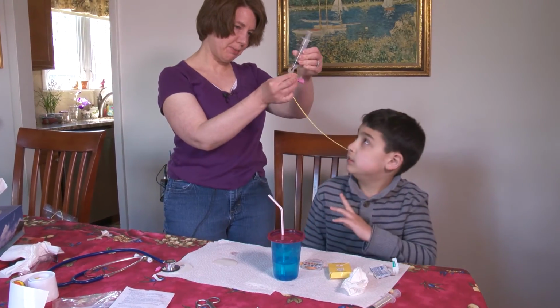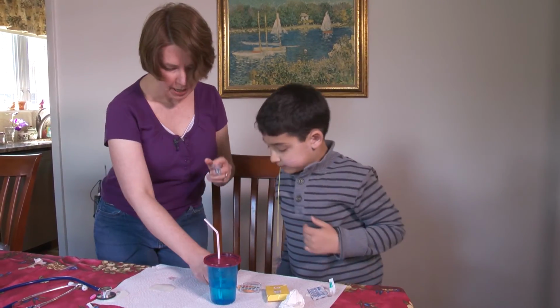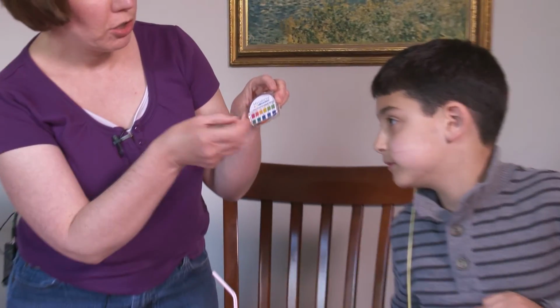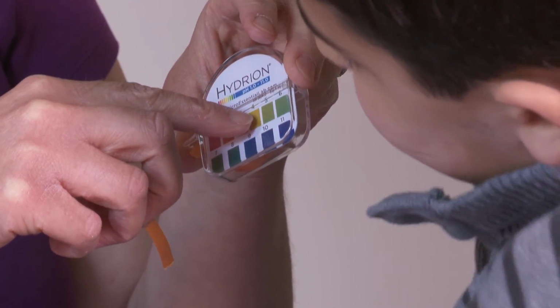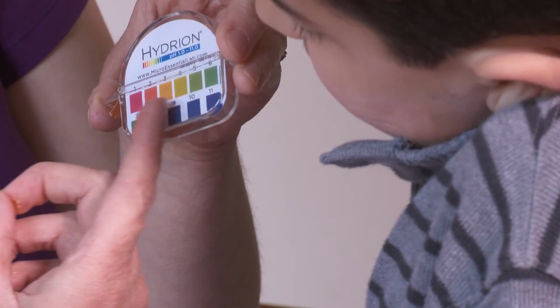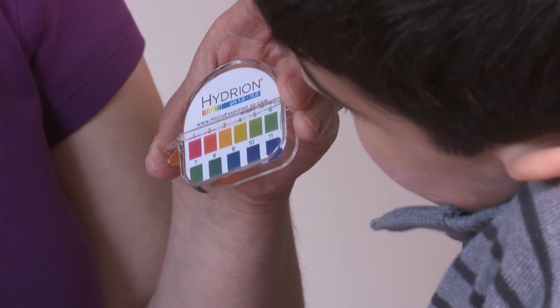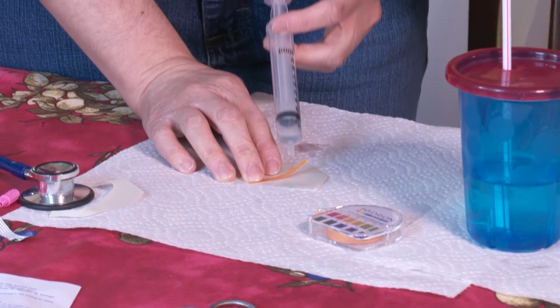So now I've got some water that was in his stomach. Well, that's what it looks like. It was your stomach contents. And I have a little piece of pH paper. Now, the pH paper, if it turns to a color pH of 1, 2, 3, or 4, then that's stomach contents. If it turns to a pH that's like turning dark blue here, like 9, 10, or 11, then it's too far in. It's in the duodenum, in the small intestine. It's not in the stomach. And if you don't get any stomach contents, then it's just not in his stomach. It's probably in his esophagus, and you need to go forward a little bit.